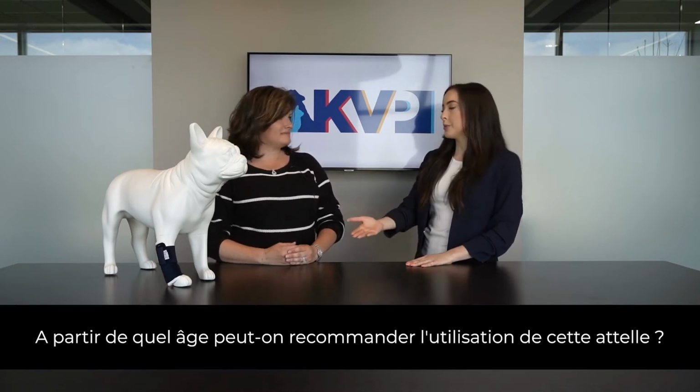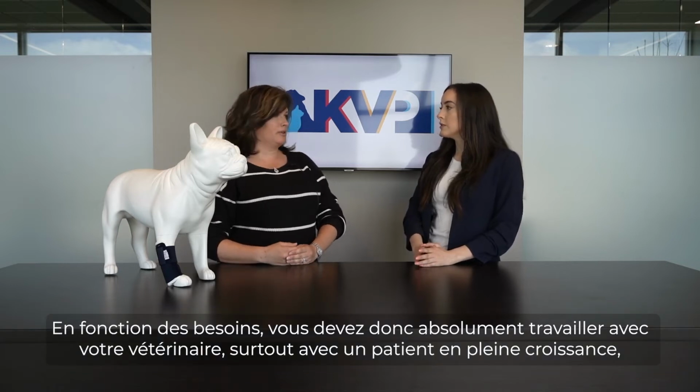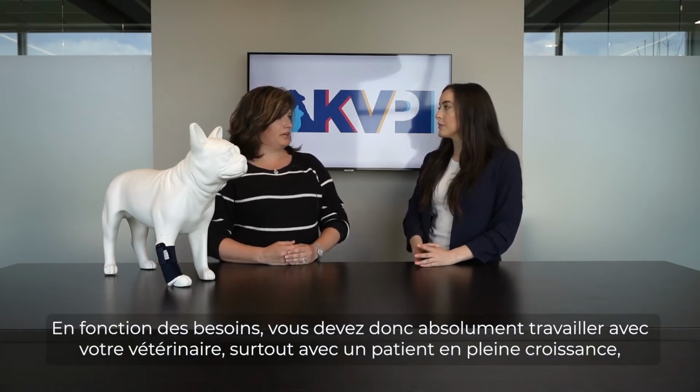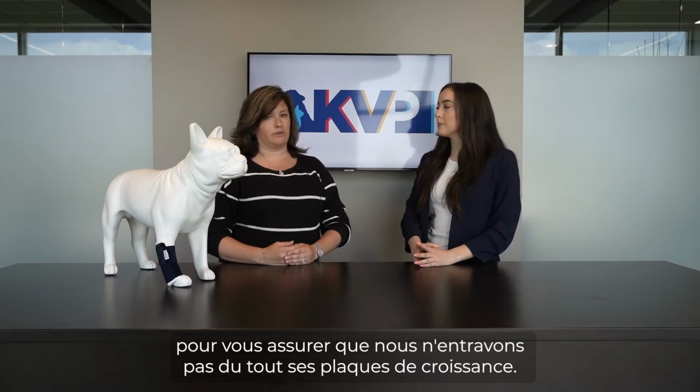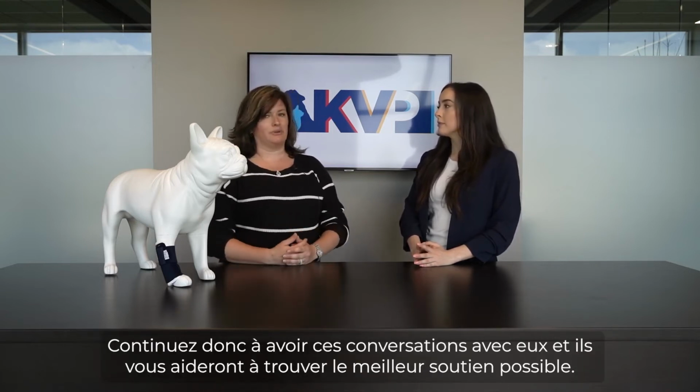So what age would this brace be recommended for use? Depending on need, you definitely want to work with your veterinarian, especially with a growing patient, to make sure that we don't impede those growth plates at all. So continue to have those conversations with them and they'll help you with the best support.